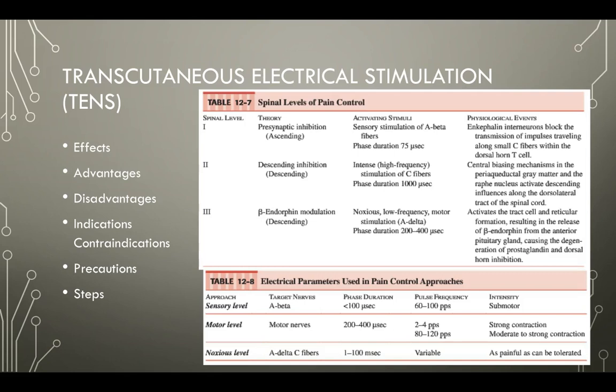We are doing nothing to actually help the tissue recover. And so TENS should be used in concordance with other things, especially exercise, right? Our number 1 modality. By using the TENS, we can help promote the healing process, because remember the pain spasm cycle. So if we remove the pain, we can hopefully help reduce the spasming that's happening in the area, which would then allow the area to be more likely to progress through the inflammatory, proliferation, and maturation phases.